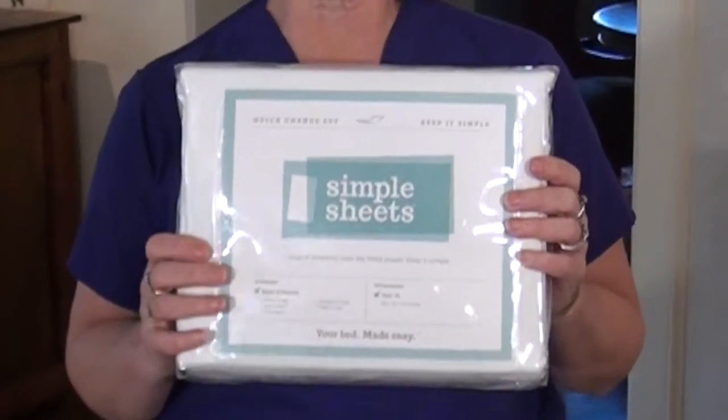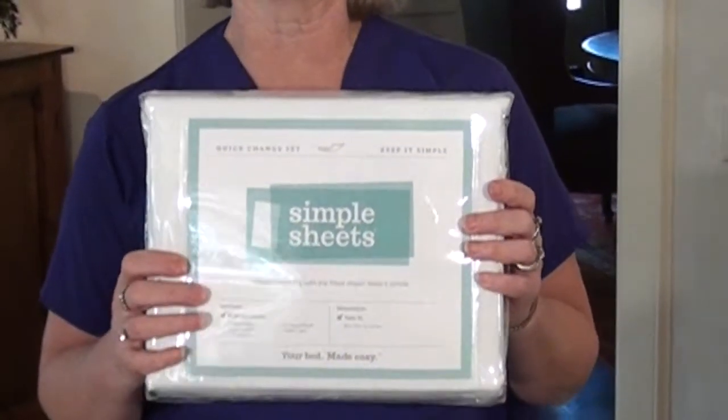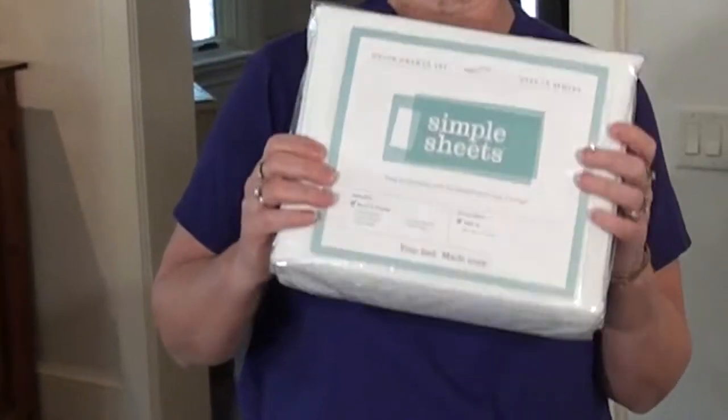My name is Karen and I've been a registered nurse for 42 years, and 10 of those years I've been a home hospice nurse. I want to tell you about Simple Sheets, which is an amazing new product that will help save time and energy for the caregivers and the nurses.